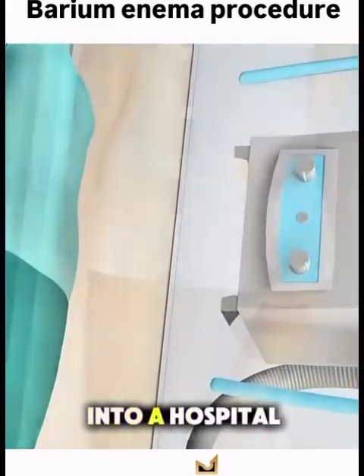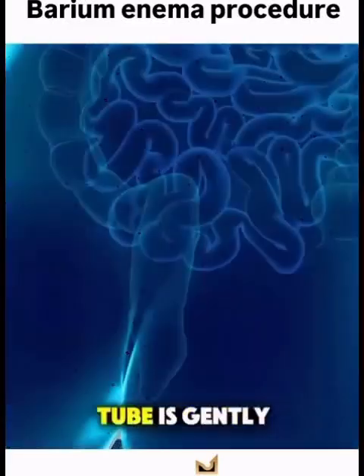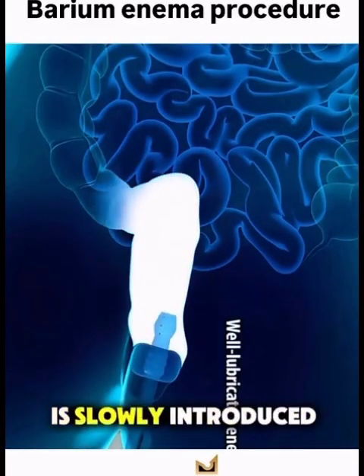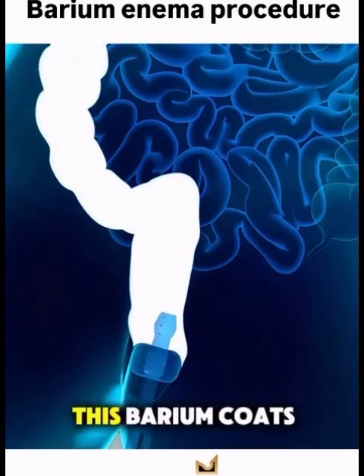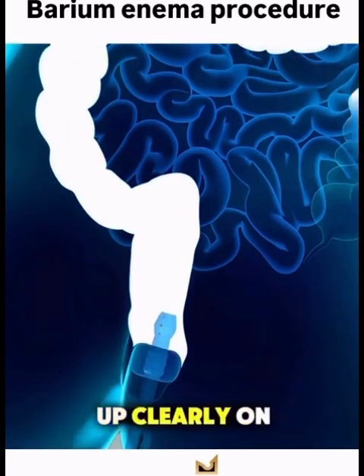First, the patient changes into a hospital gown and lies on an x-ray table. A small, soft tube is gently inserted into the rectum, and a liquid called barium sulfate is slowly introduced through the tube. This barium coats the lining of the colon, making it show up clearly on x-ray images.